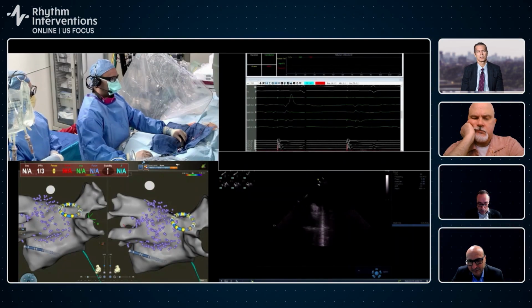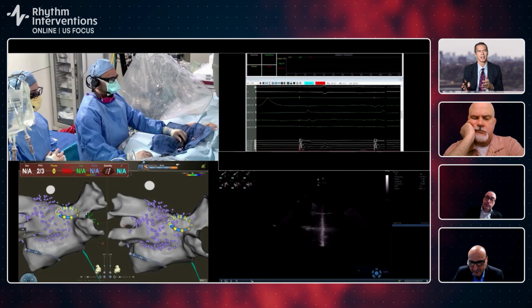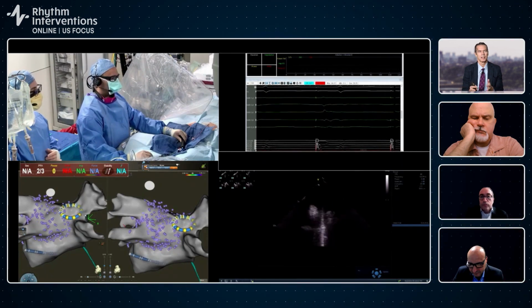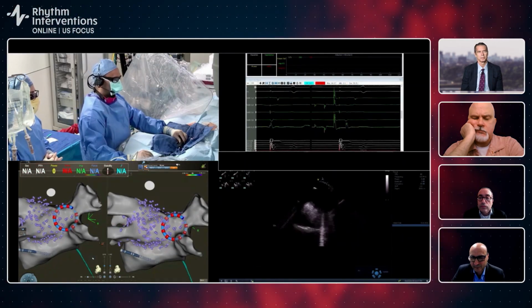In the Admire publication, they talked about the results in patients who had ultra-high density mapping before and after, or just using this catheter to map afterwards. What has been your workflow or thoughts about using this to do a post-ablation map?